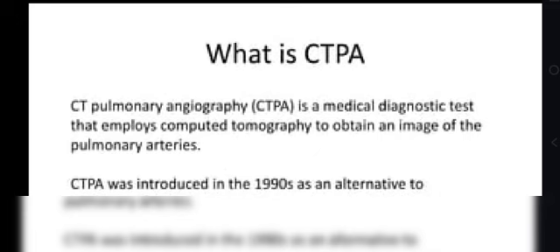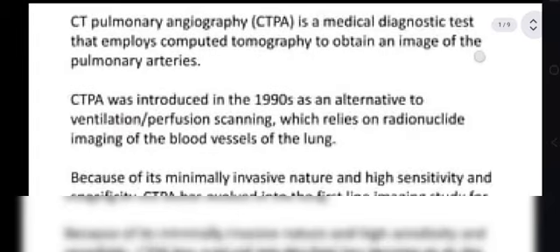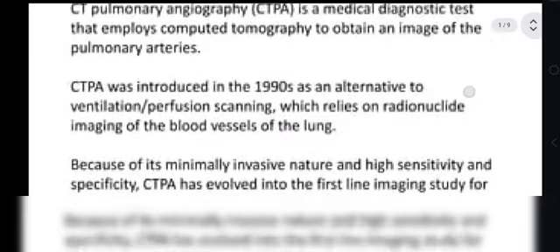CT pulmonary angiography is a medical diagnostic test that employs computed tomography to obtain an image of the pulmonary arteries. This was introduced in the 1990s as an alternative to ventilation or perfusion scanning, which relies on radionuclide imaging of the blood vessels of the lung.